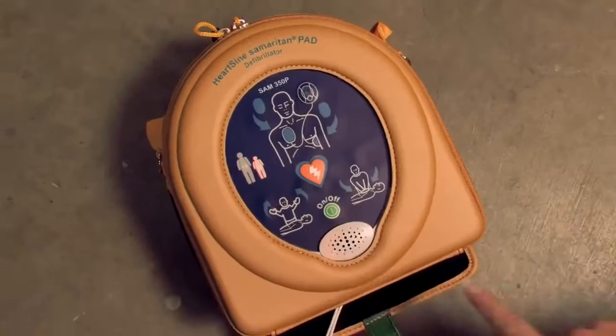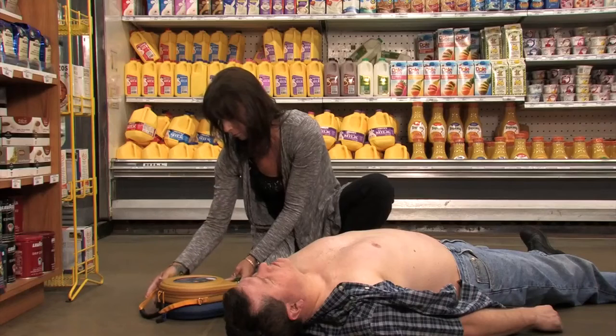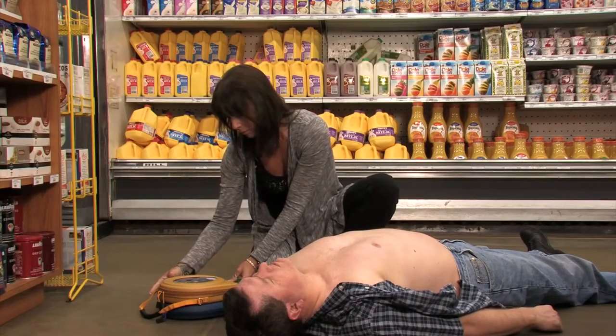Press the green ON button. The device will automatically identify an adult or pediatric patient based on which pad pack has been inserted. Adult patient.